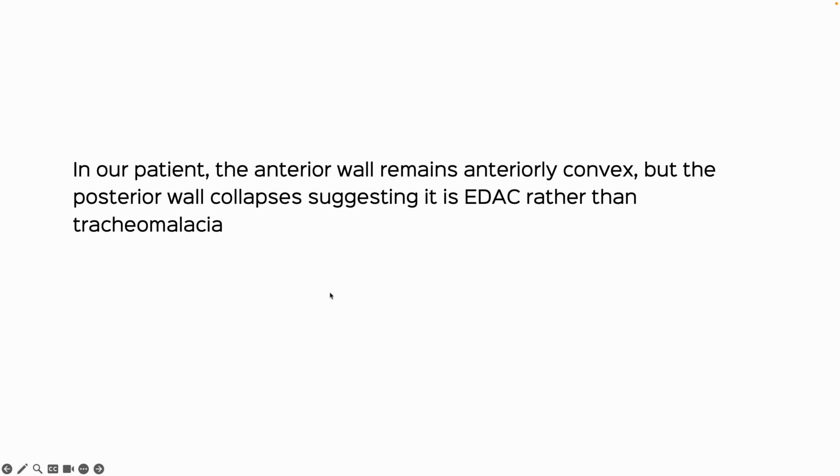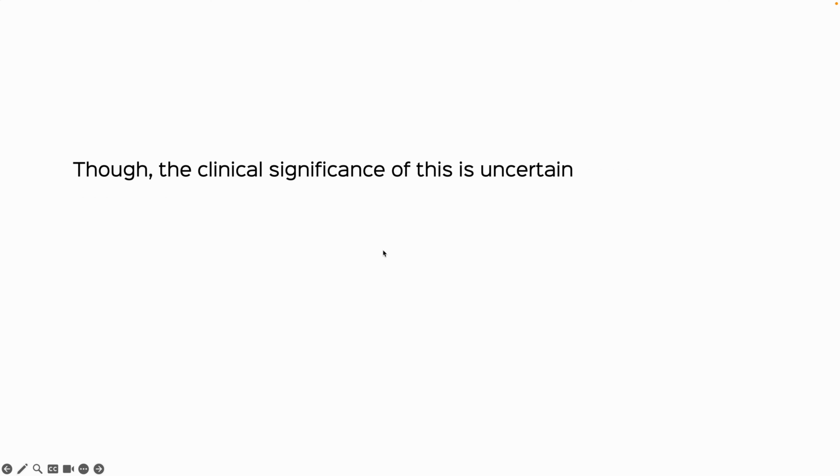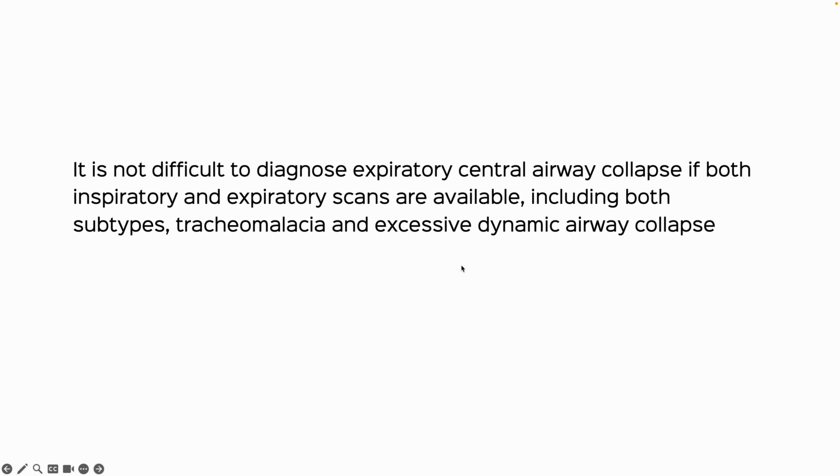So in our patient, the anterior wall remains anteriorly convex, but the posterior wall collapses, suggesting that this is EDAC rather than tracheomalacia, though the clinical significance remains uncertain.